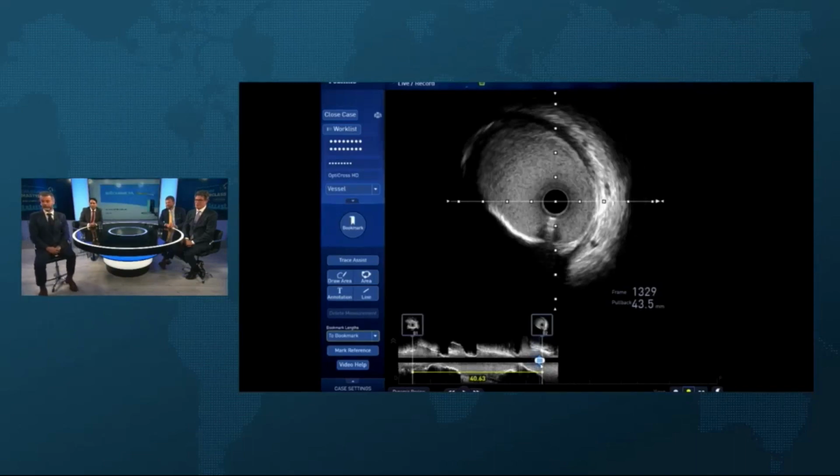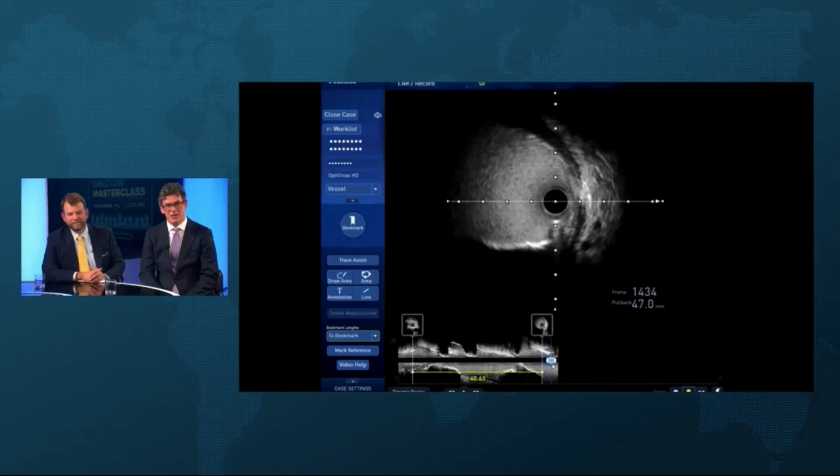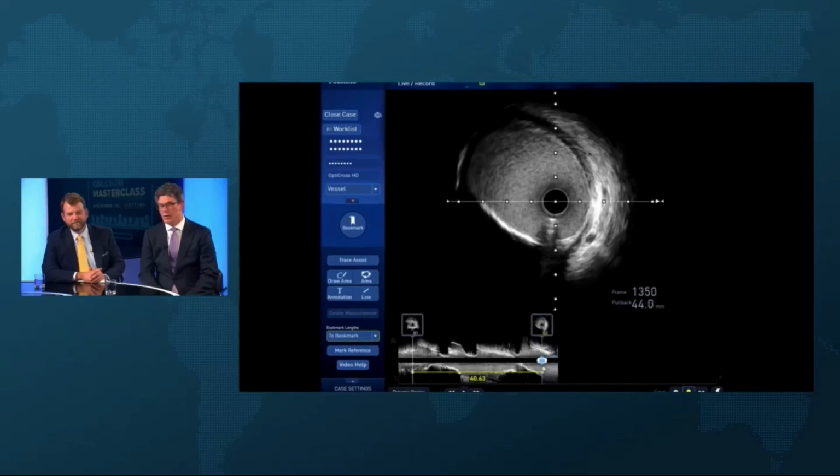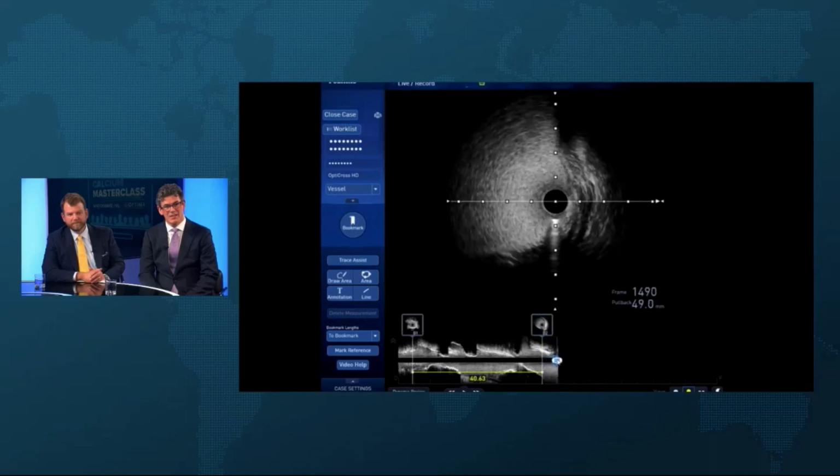So you're going to have the proximal edge of the stent over the circ, aren't you? So with more struts. Yeah. Well, what's the gap between that and the ostium? It looks like there's still 4 millimeters there. Can you maybe mark the ostium of the LAD, the ostium of the circ? Okay.